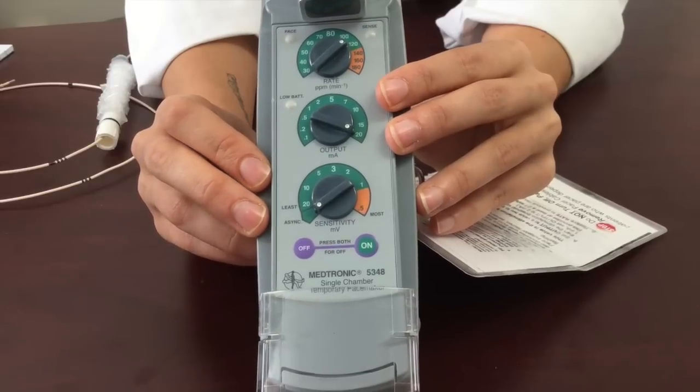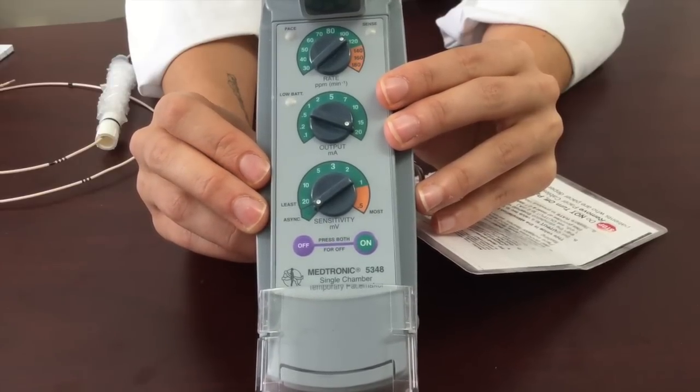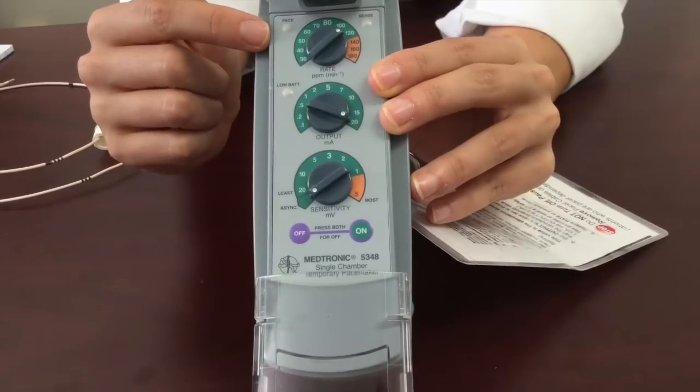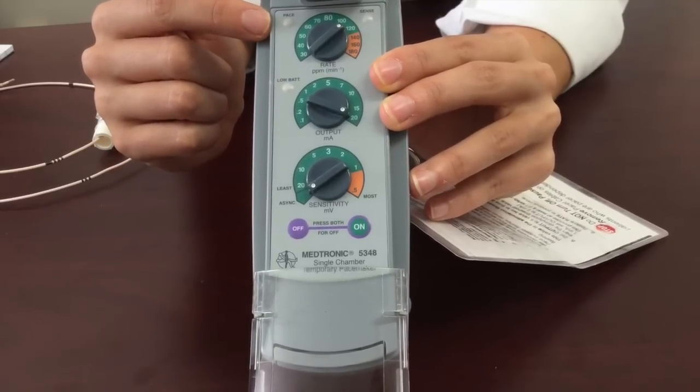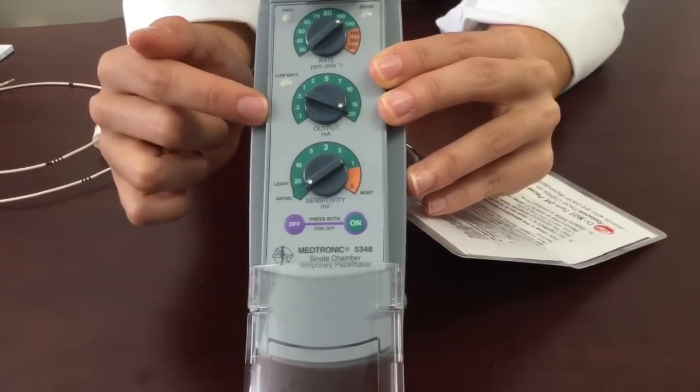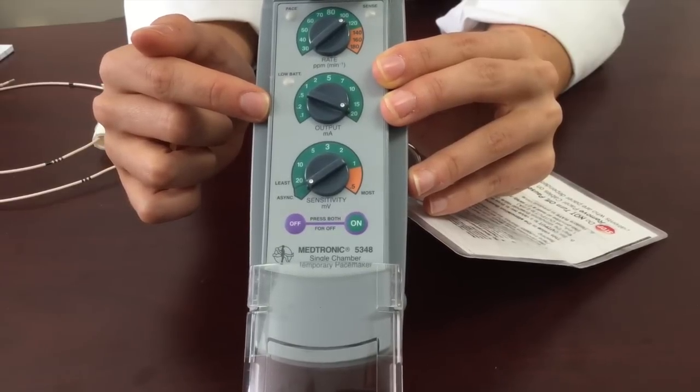Now we are going to talk about the box and the initial settings. What you are going to notice is that the heart rate is set to 100, and we have it at the maximum milliamps to ensure that we get maximal capture when it is time to place the pacemaker.